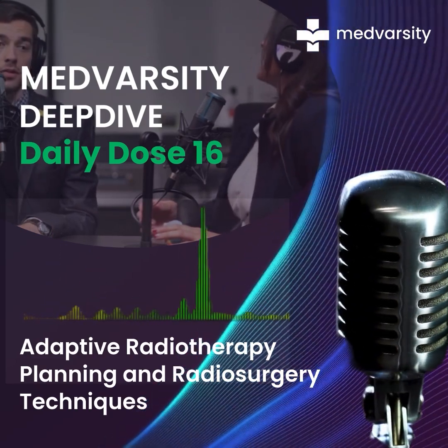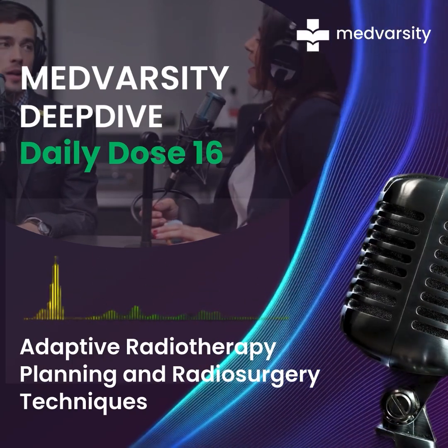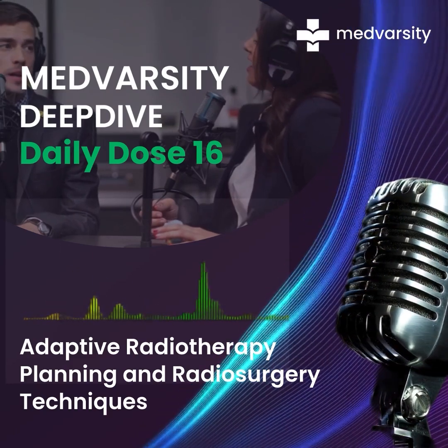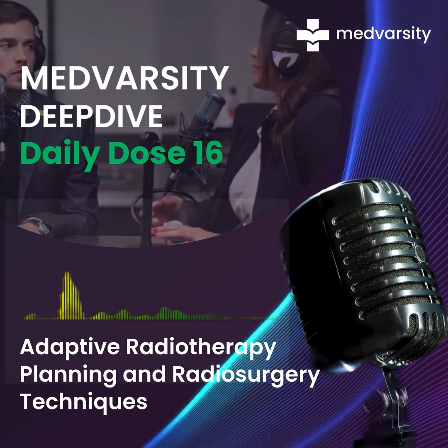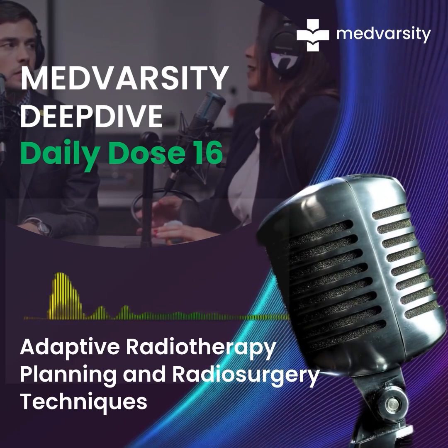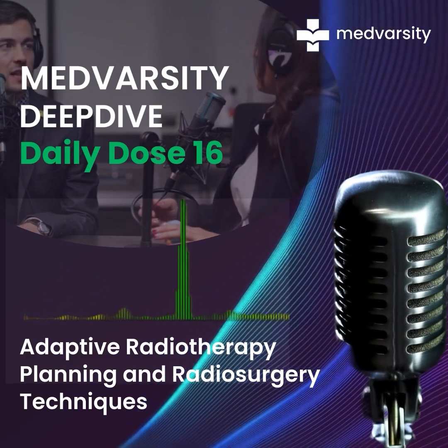I've heard of a gamma knife, but cyber knife sounds like a sci-fi movie. It does. What's the difference? So gamma knife uses a fixed frame that's attached to the patient's head to make sure that it's accurate, and it delivers radiation from multiple different cobalt sources. Okay. Cyber knife, on the other hand, is frameless, and it uses a robotic arm to deliver radiation from a linear accelerator. So it's like comparing a stationary turret to a sniper rifle that can move wherever it needs to go. Yeah. Cyber knife sounds a lot more flexible.